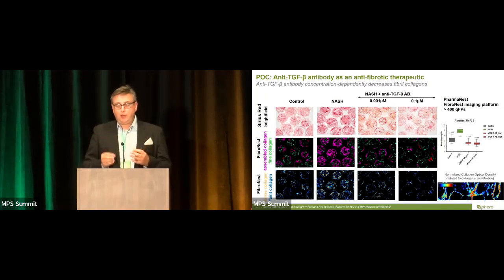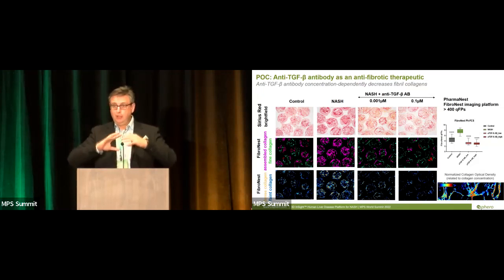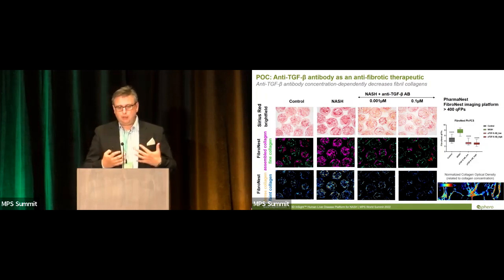The fine collagen fibers are fairly young collagen fibers that are not yet fully embedded into assembled networks. They are an important drug target for us because they are much easier decomposed by MMPs in the system than a much more solid and rigid assembled fibril network. And then on the lower end, you see dense and faint collagen. So we get a lot of extra information from this machine learning approach.